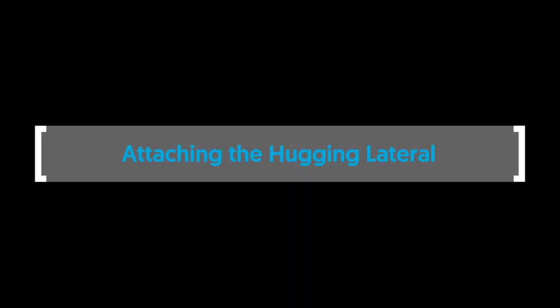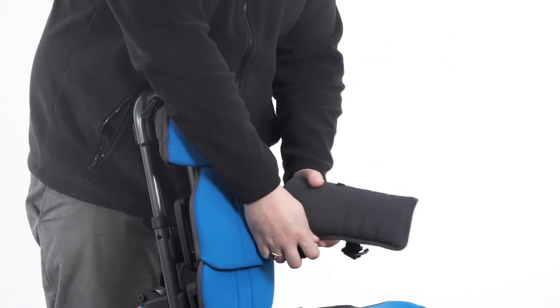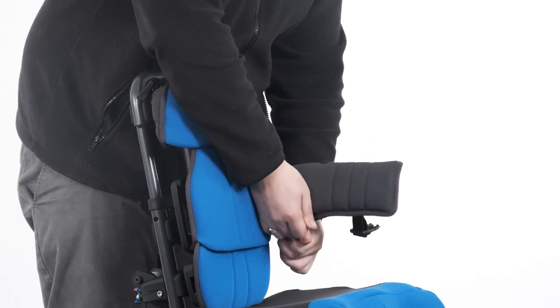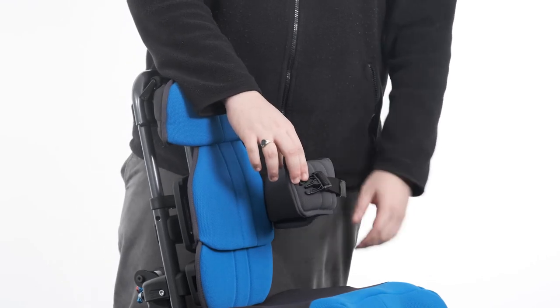To attach the hinged lateral covers, undo the velcro and slide the cover over the plastic pad with the velcro facing downwards and the surface with the black webbing facing outwards. Secure in place with the velcro.